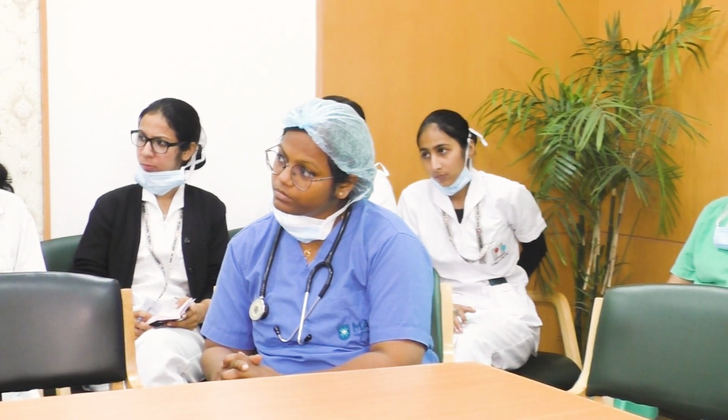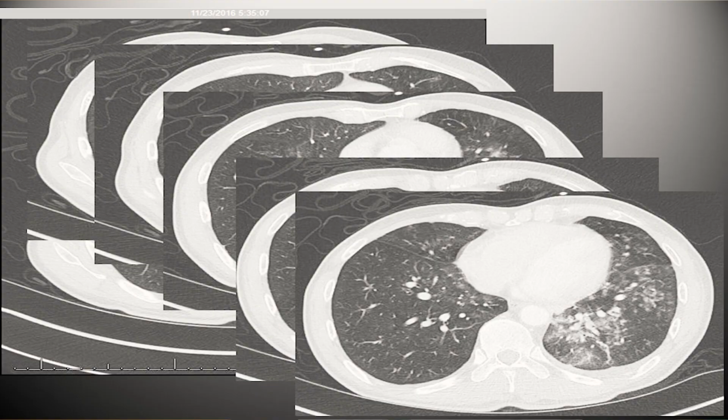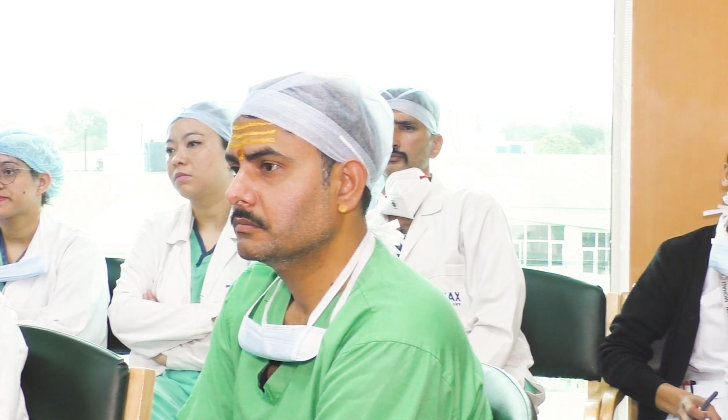Suppose you see lesions on both sides of the chest in the CT scan, you still need to know which side is bleeding. So if time permits, then do a bronchoscopy. So this is a very classical picture, when we see acute on chronic hemoptysis, there will be some findings on the CT. And here we see that the left side is showing consolidation. And if we see serially, many times you won't see those florid changes like we are seeing here.